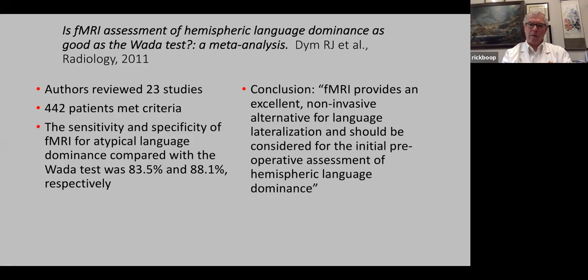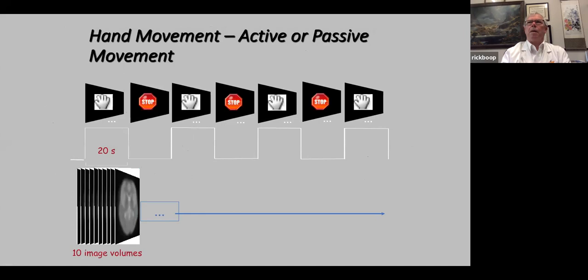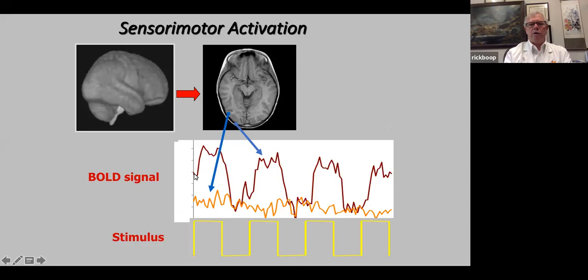So when we look at non-invasive brain mapping paradigms, typically what they involve is recording images in an activated state versus a resting state, and then using subtraction algorithms to subtract the activated signal from the resting state noise, and then superimposing that signal on an MRI or a CT so that we can see which region shows changes.